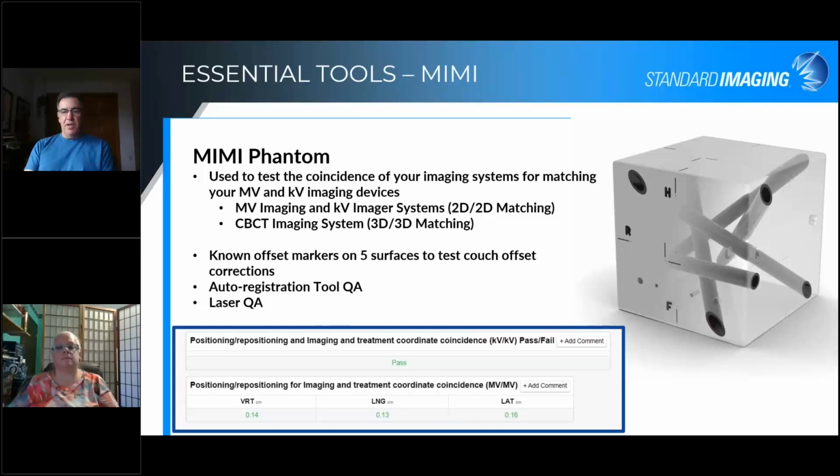And the nice thing is, if you're doing a cone beam image set of your phantom, you don't have to hunt for targets within the phantom. Those rods show up at just about every slice, so no matter where you are on the phantom, you'll have targets to key in on. That saves time and makes it easier to use than looking for internal targets that you can't necessarily see. Anything making life faster and easier in the morning, I'm sure the therapists and physicists really appreciate.